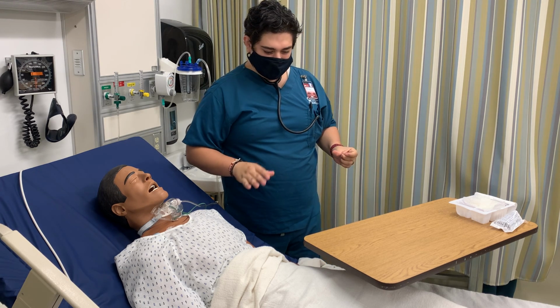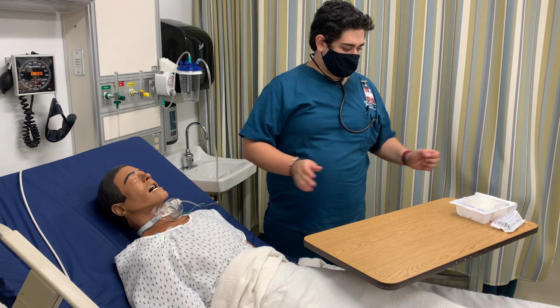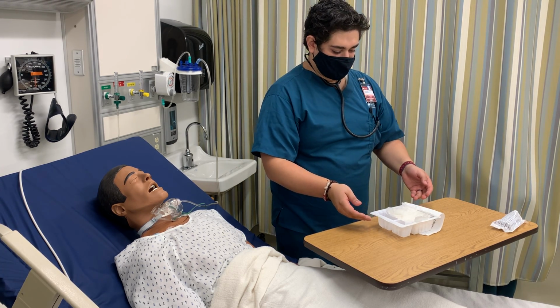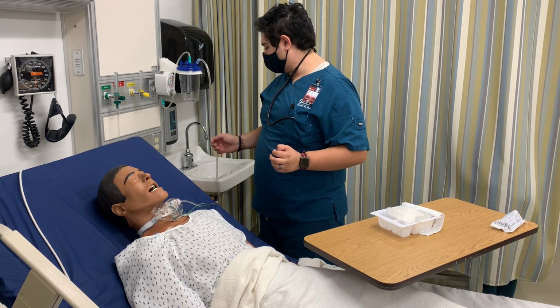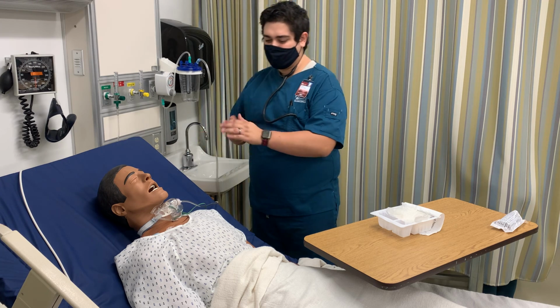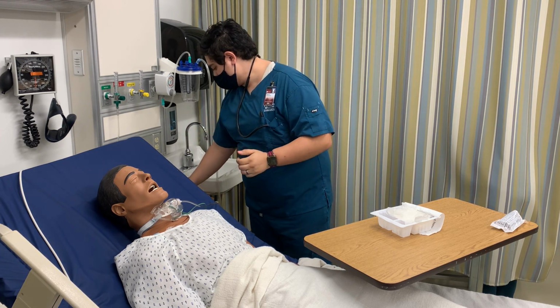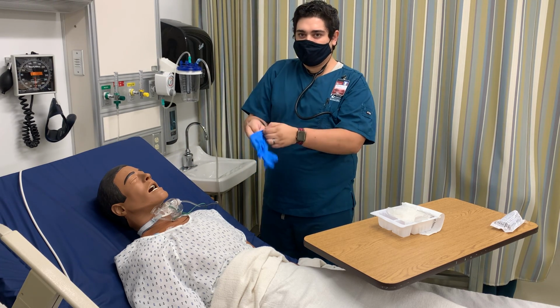So he is doing good. His skin is good. Give him a couple minutes to catch up. Here, I'll be setting up my next procedure, which is replacing the equipment here. Replacing and cleaning. Hand hygiene. I will be donning clean gloves.